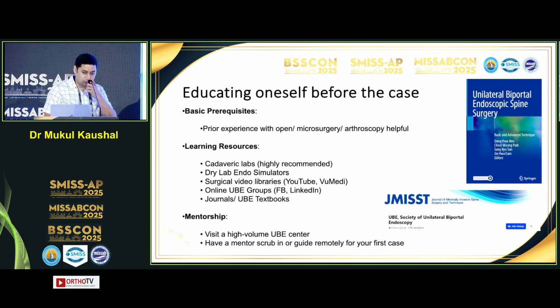So, educating oneself before even taking up a case. The basic prerequisite is that you should have some prior experience with open microsurgery, or if you're an orthopedic surgeon, prior experience with the arthroscope is going to be very helpful. There are a lot of journals, there are a lot of textbooks now. This is an established technique.